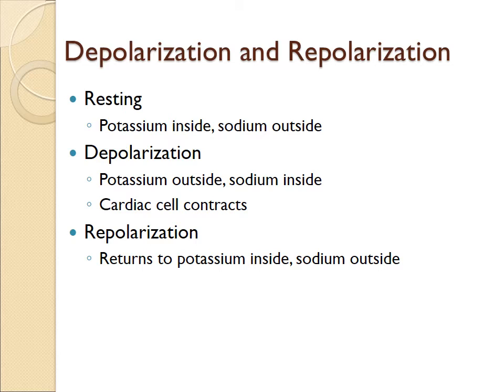This is important because certain medications are given based on this, as well as certain PVCs that we're going to be concerned about depending on when they occur in the cycle of depolarization and repolarization. So you need to file that back in your brain as we advance you through the different levels of ECG analysis.